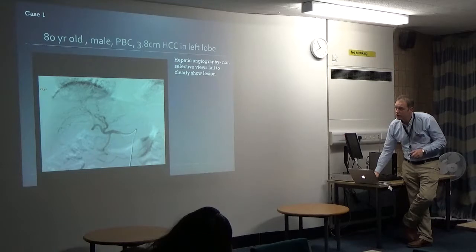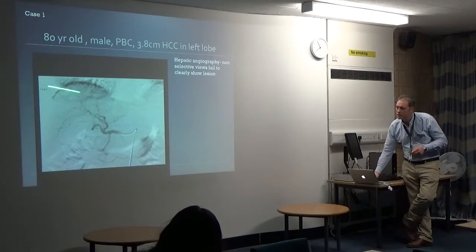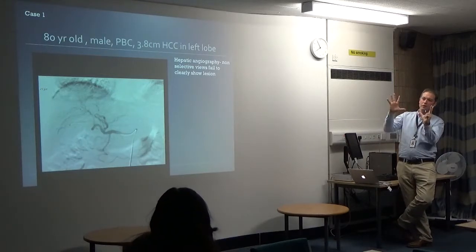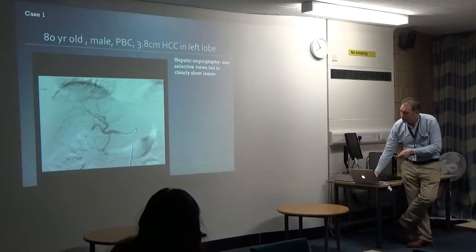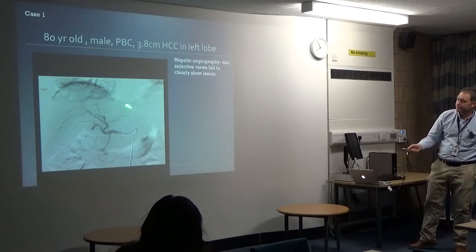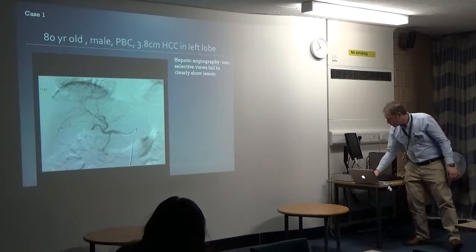So I've just got a couple of cases to show you. Here is an angiogram. Here I've put my catheter into the liver artery, and I'm not really seeing the tumour in the liver very well, because the tumour is supposed to be very vascular, so it should appear and glow like a light bulb when I do an injection. But I know that the tumour should be here. So I put my little tiny catheter that's 0.6 of a millimetre wide all the way around the houses, all the way around into here. And then we can do some more tests.